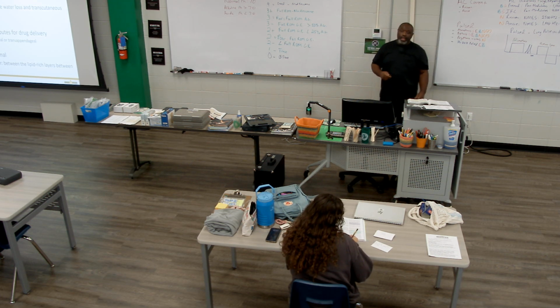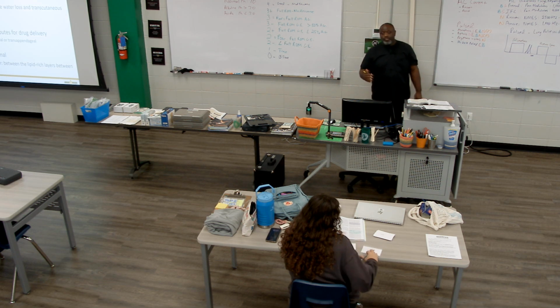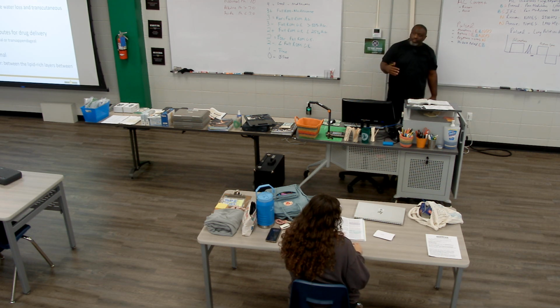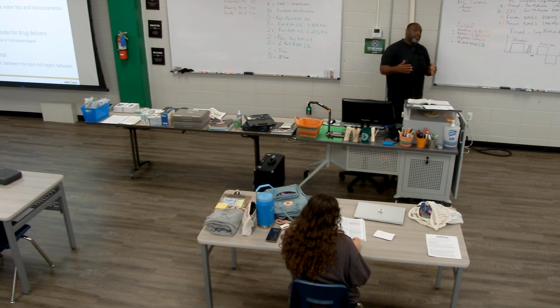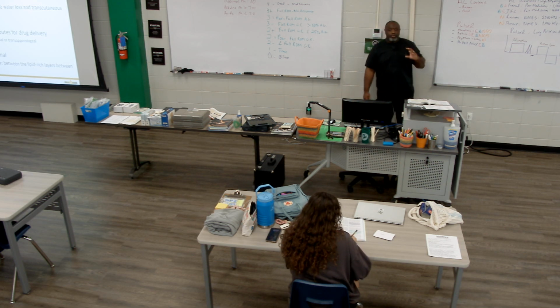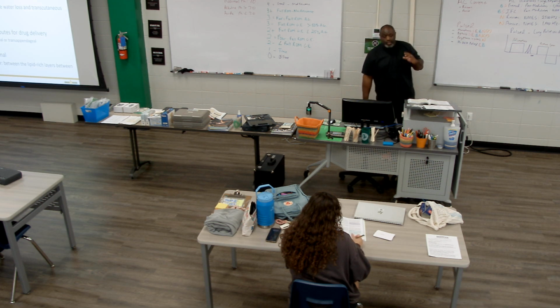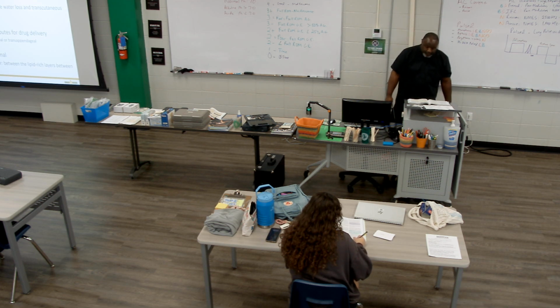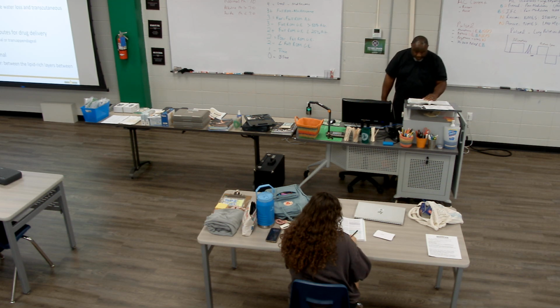So we know that we have a positive charge electrode. We call that our anode. We have a negative charge function with our E-stim called the cathode. So based on the drug's polarity, we're going to push medication into the body using the same polarity of the drug as we do the electrode. So that's the whole concept of what we're doing.